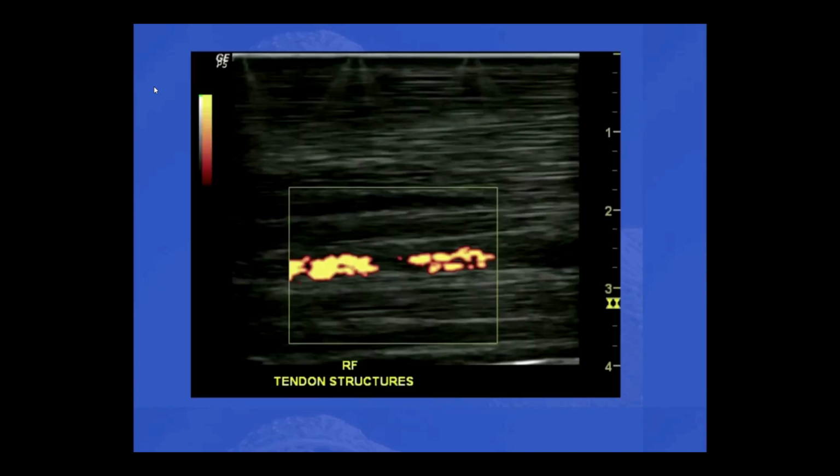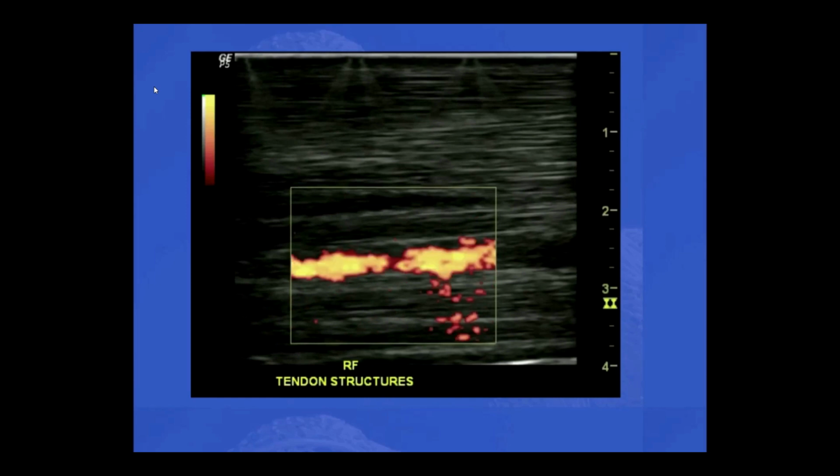Let's make it more interesting before you all fall asleep. Let's get some pictures there, and I'll start with a little video. I don't really do a lot of the imaging. I for sure don't save them in a loop because there's so much data, but especially when you have the client there, they love seeing this.